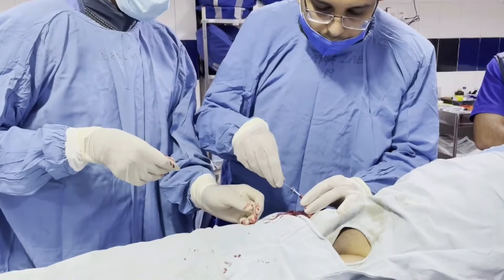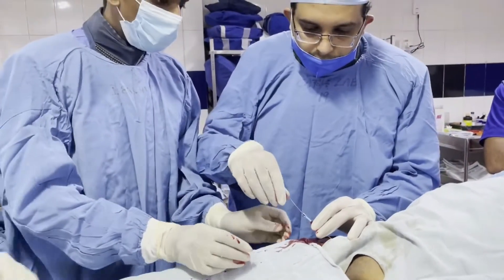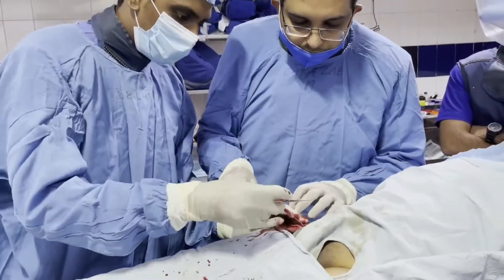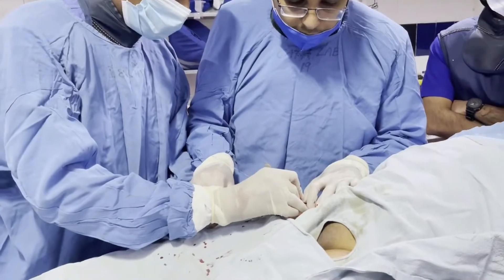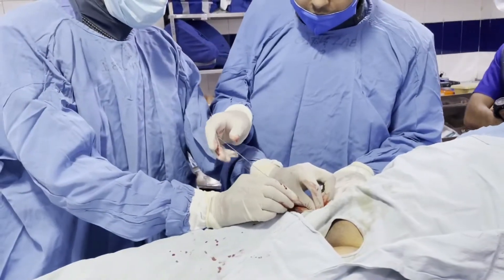You can see the wire is smoothly going into the femoral artery, which continues as the external iliac. Once we are sure the guide wire is in the femoral artery, we need to insert the femoral sheath.